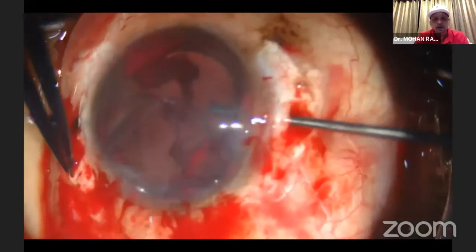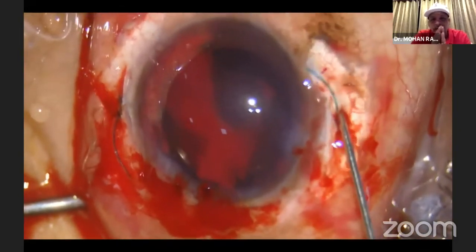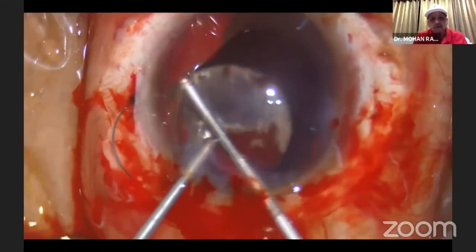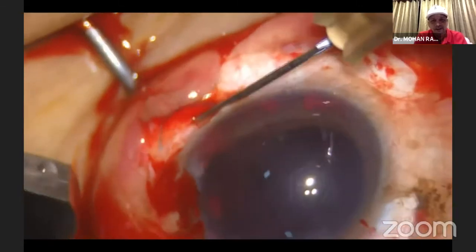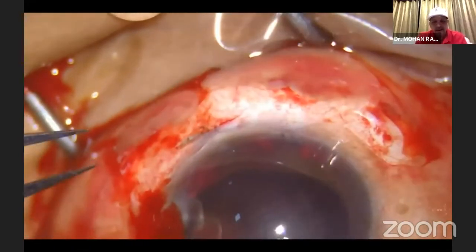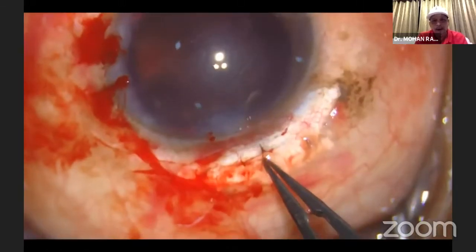And the rest is the routine steps. This patient was also on aspirin, which he didn't tell me. And you can see it's bleeding from all over the place. Whenever I touched the iris, the iris was bleeding. You can see that I'm exteriorizing and tucking that haptic into the groove, because I don't have scleral flaps on either side. Of course, we had to do triamcinolone-assisted anterior vitrectomy here. I have to suture that because I don't have a flap, making sure that there's no hypotony on that side.